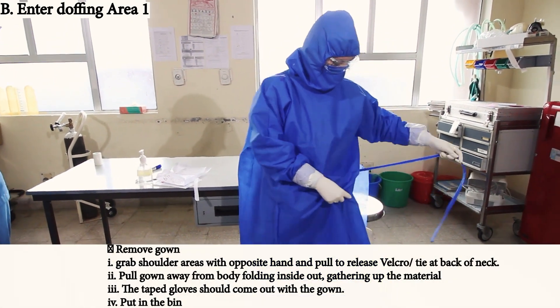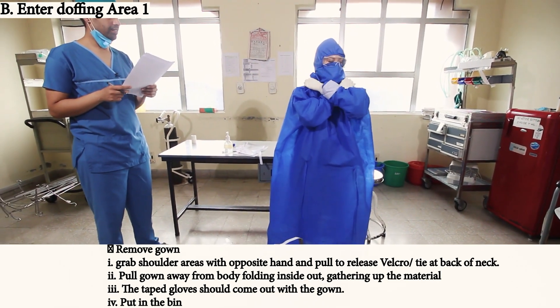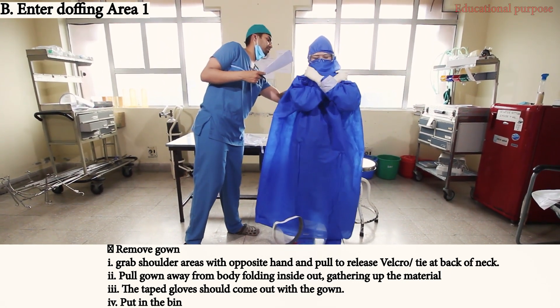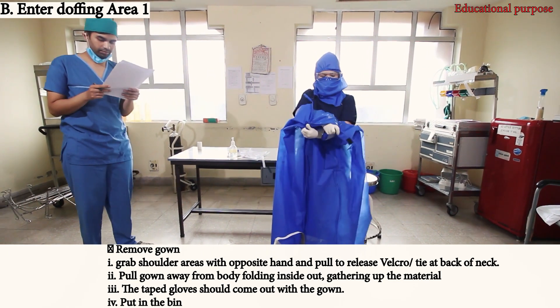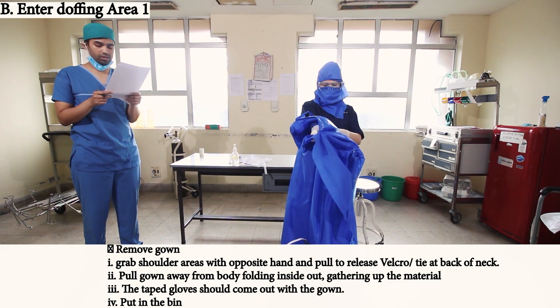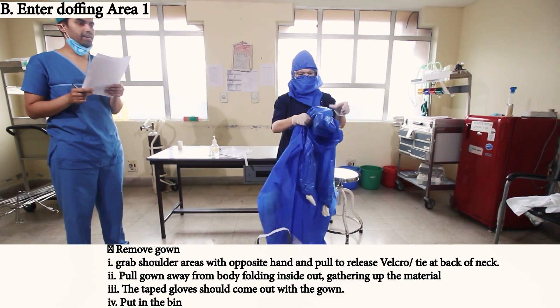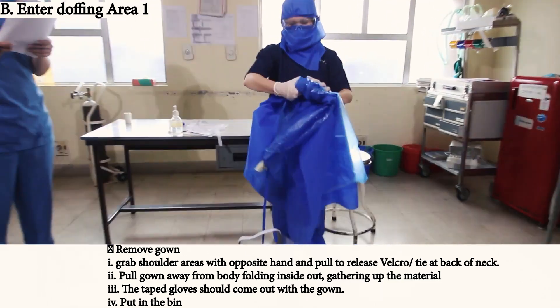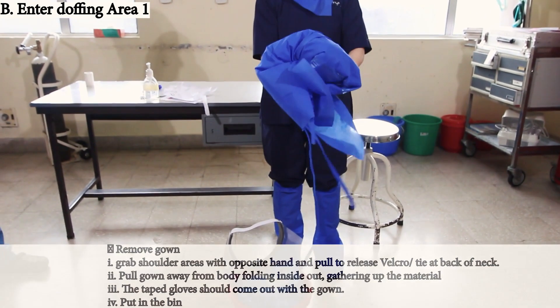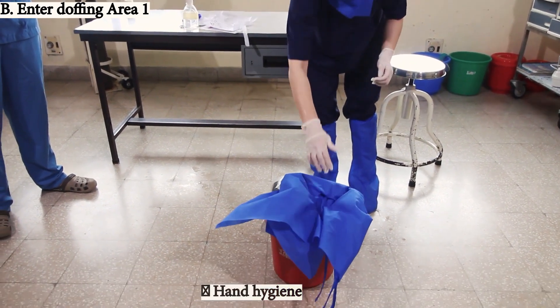Remove the gown. Grab the shoulder with the opposite hand and pull to release the velcro tie. Pull the gown away from the body, holding it inside out, gathering the material. The taped glove should come out with the gown. Put it in the bin, then perform hand hygiene again.